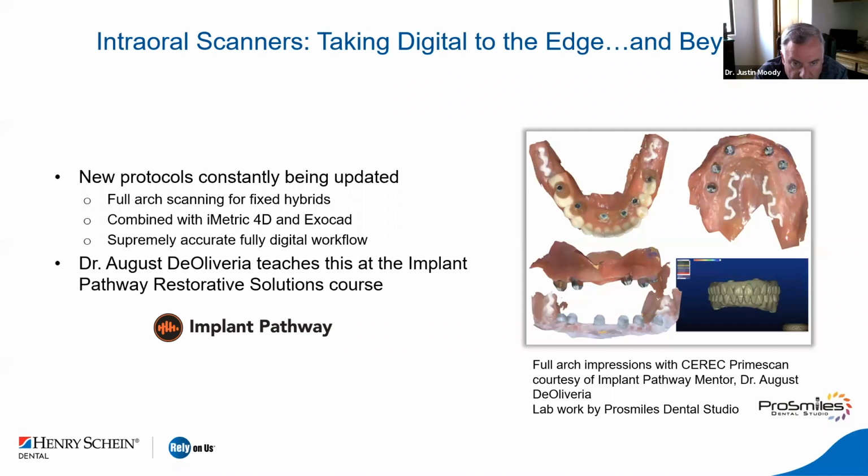Because some of the fears of full arch, there's two kinds of fears to full arch implant restorations. We have the fear of the surgery itself and placing the implants in the right spot and being prosthetically driven. But there's also a fear of the prosthetic itself. How do I take these records? How do I create the position of 8 and 9 as it fits in the patient's face to give them the best aesthetic profile? There's a lot to go in there.